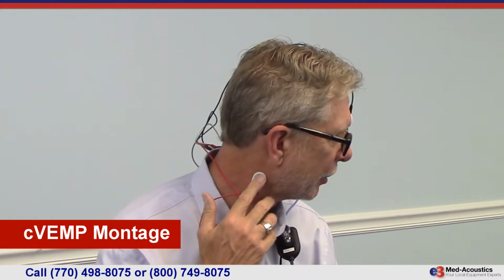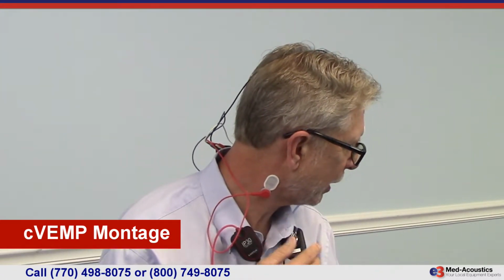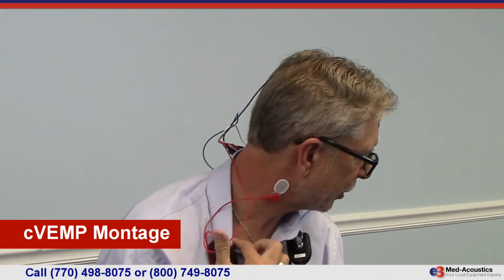Notice that I have the two reference electrodes, and sometimes they're called the inverting electrodes, sometimes they're just labeled minus versus positive. Anyway, they're on my sternocleidomastoid muscle. And you can see when I contract this by turning my head and trying to touch my shoulder with my chin, as this muscle contracts, that it begins at the earlobe and goes all the way down to the clavicle.